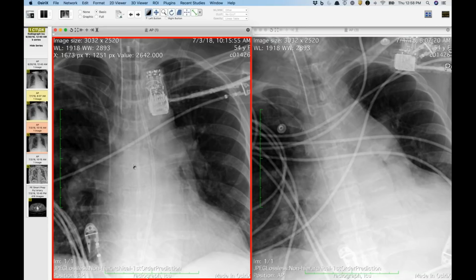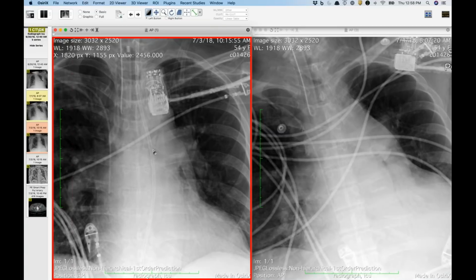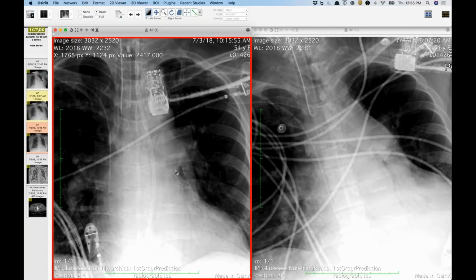There's a stent in the left main bronchus on that. You think it's a stent, but it's not. So that tells you exactly what it is. But now you're seeing an outline of the left main stem bronchus, and you may see a little bit too much of the right paratracheal region. You see the right wall of the trachea. So I saw this and thought this was probably pneumomediastinum. Well, I knew it was pneumomediastinum because they hadn't done anything.